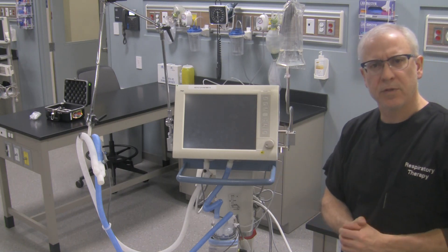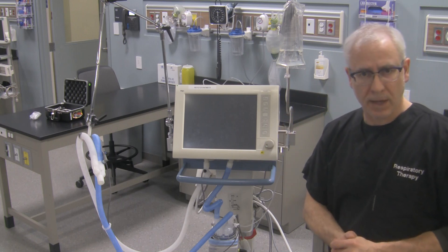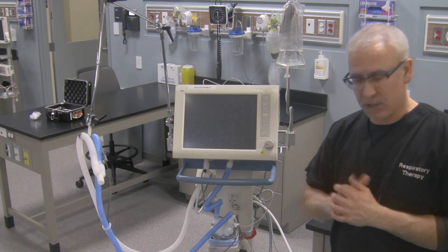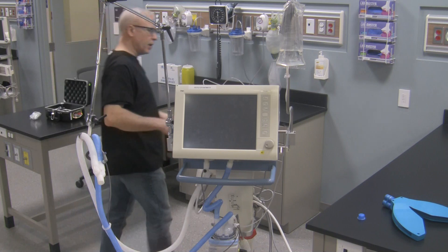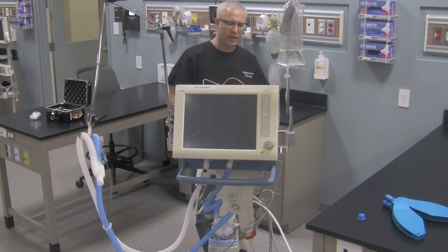So before we access the pre-use check, we need to turn the ventilator on and then put the ventilator properly into standby, and then access the menu for the pre-use check or the device check. So I'm going to go to the back of the machine. Remember, the on-off switch is at the back. I'm going to turn the ventilator on. You're going to hear an alarm.